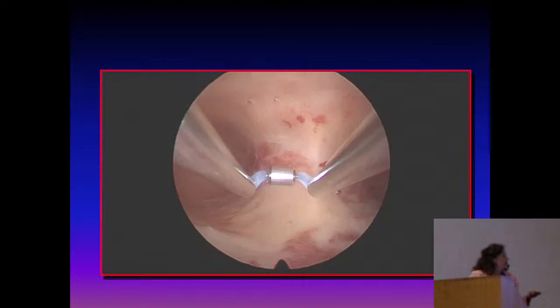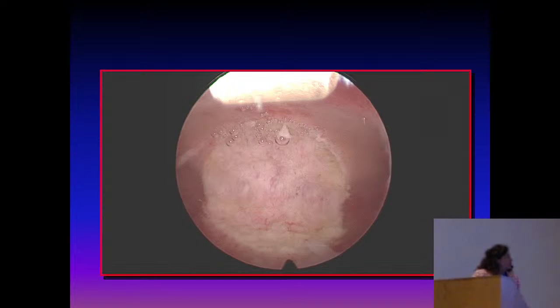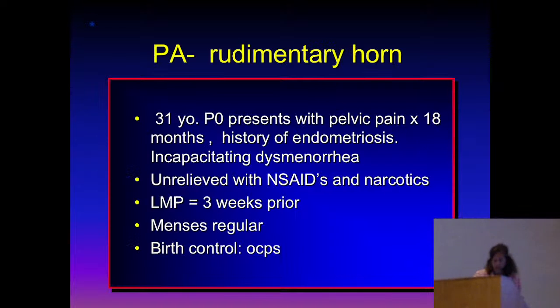3D, your partial septum. And we were talking about that yesterday, but we used to use the resectoscope with this roller ball, and it was very, very quick. And now we get away from the cautery and do more scissor or a combination of a scissor to start and the mechanical morcellator to finish. But the morcellator doesn't work for the whole thing that well. It's really until you start with the scissor. So rudimentary horns are easy to diagnose with the 3D.